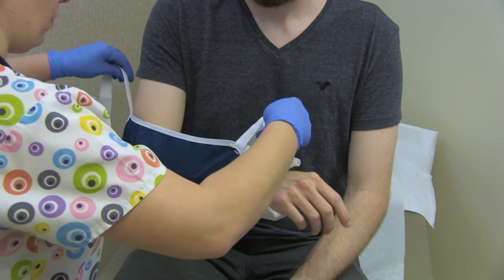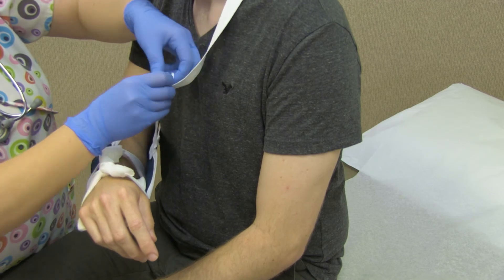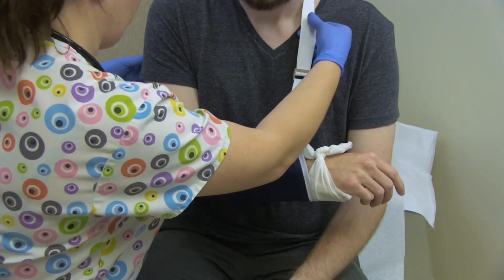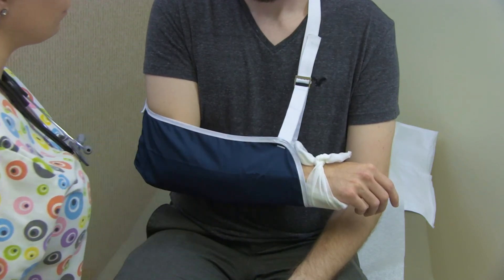Apply a sling to keep the arm elevated. Update the provider and document in the patient's medical record.